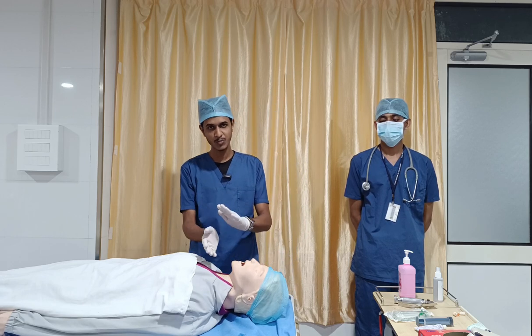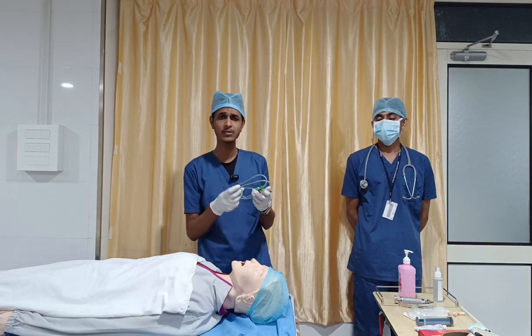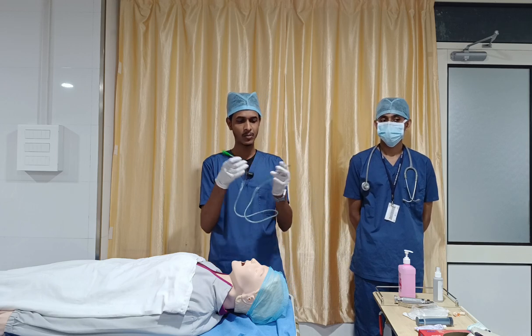Okay, this is the way you have to position the person. Then, getting into the procedure, I have to take the appropriate size, either 12, 14 or 16 French Ryle's tube. So I will tell the parts first.